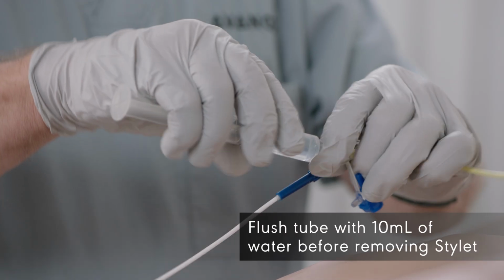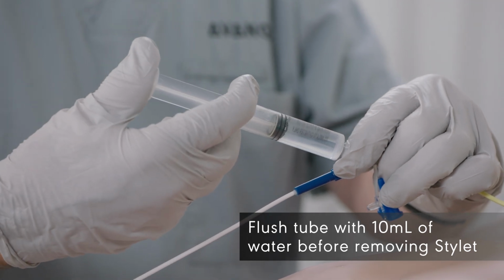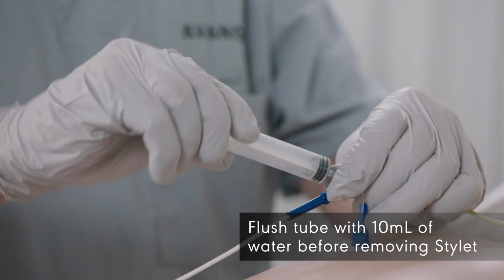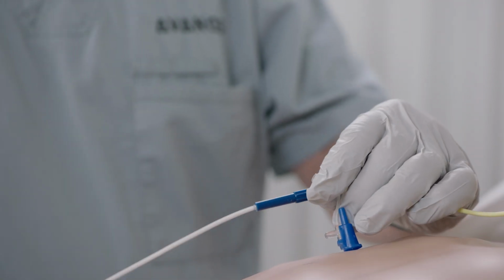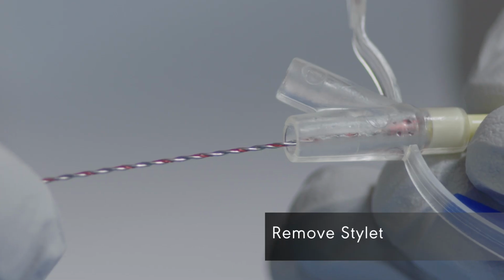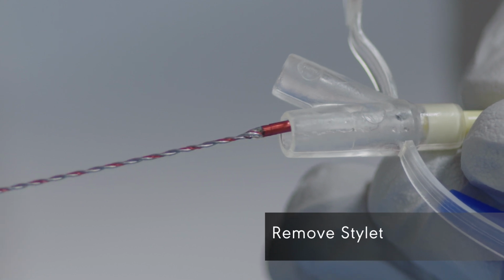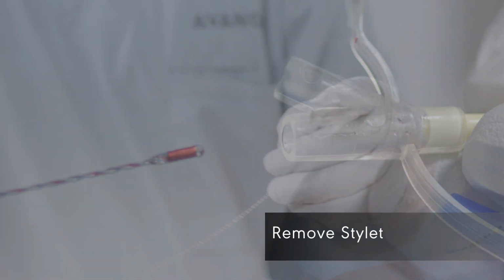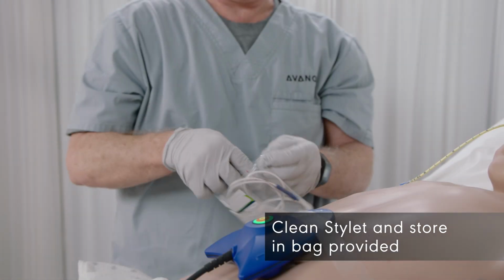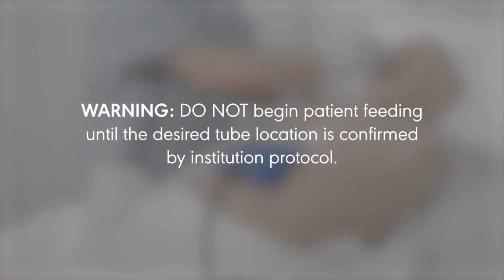Flush the tube with 10 milliliters of water before removing the stylet. Then, remove the stylet. Clean the stylet and store it in the bag provided. Warning: do not begin patient feeding until the desired tube location is confirmed by institution protocol.